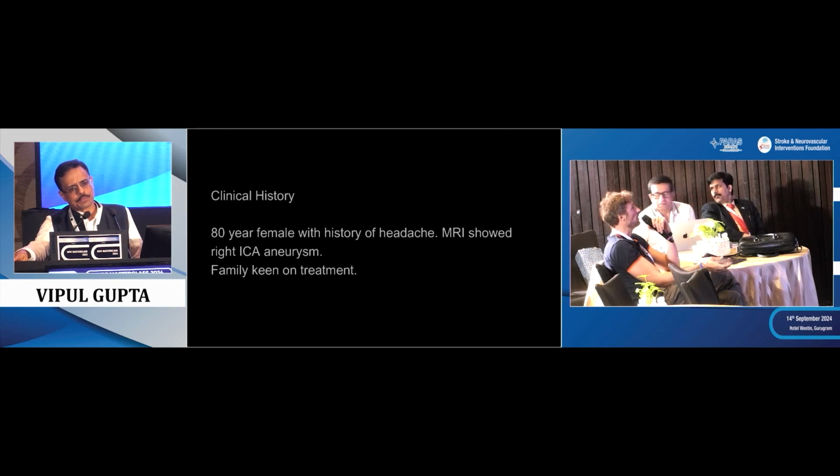Yeah. It was straight, the diameter was larger, so the risk for flow diversion complication was lower, the size of the vessel as well, the importance of the flow. So it was for me a very good indication to try to keep the artery patent, especially because he's young. I think it's also something we need to take into account. And she needs all his brain at maximum to continue his career. So yes, I understand that you wanted to be conservative, and we have the tool, because the 017 microcatheter with a flow diverter was not there before.